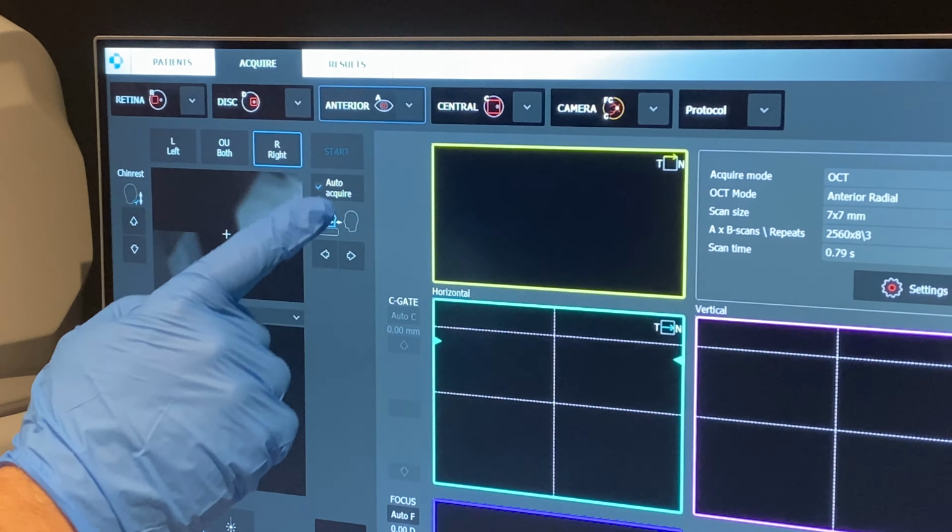Let's just close that a minute. You know when it says 83 of 128, that's the 83rd image that you've got of 128 in total that you've taken. Not for that particular patient, but just in total. No, for that scan. Oh, for that scan. Okay. So if I roll off image 83, I won't see my notations that I put on. So if I then go to image 84, it's not there. And if I roll back to 83, it's there.